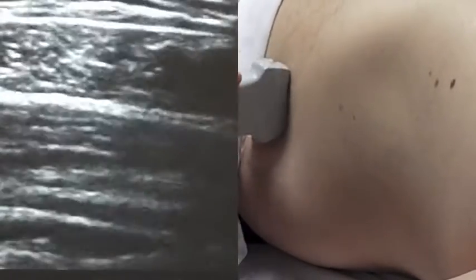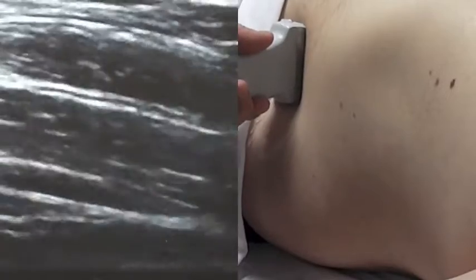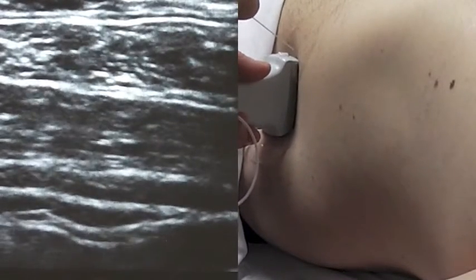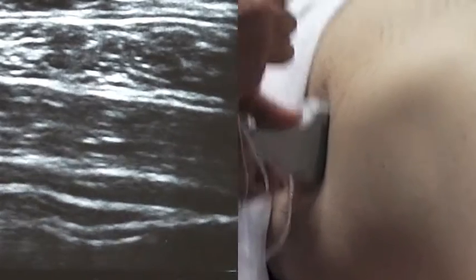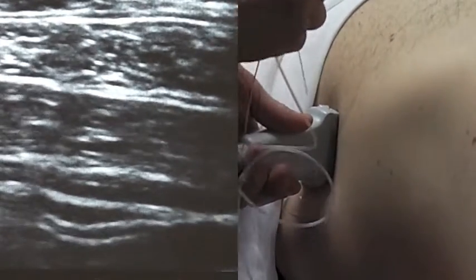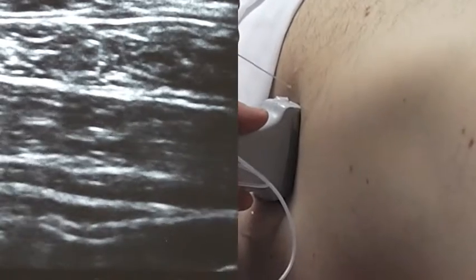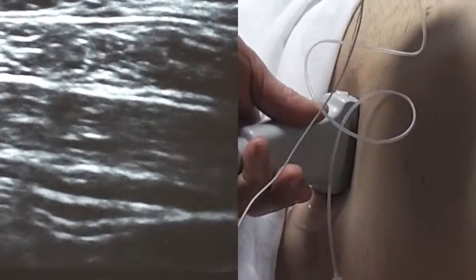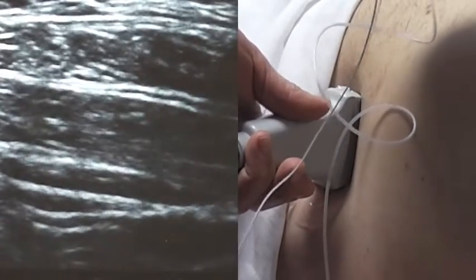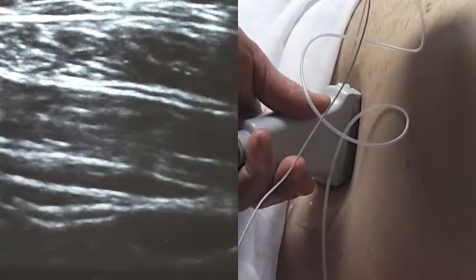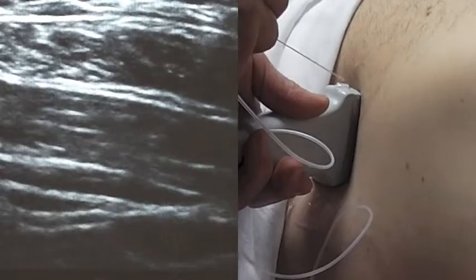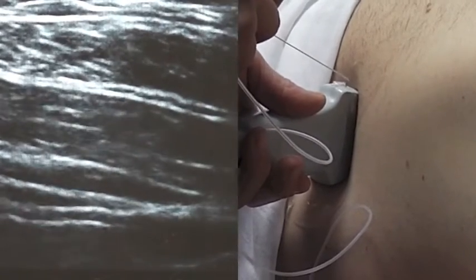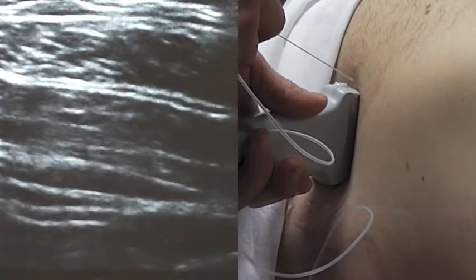To place a catheter or needle in these patients, we use an anterior to posterior approach. The needle placement is about a half centimeter to a centimeter away from the ultrasound probe. The direction of the needle is towards the spine, not hugging the probe — because if you hug the probe, all you're going to do is pierce the skin and the upper layers of the abdomen. It's a little unnerving initially because you're pointing a needle right towards the patient's abdomen, but that's where your target is: between the transversus abdominis and the internal oblique.